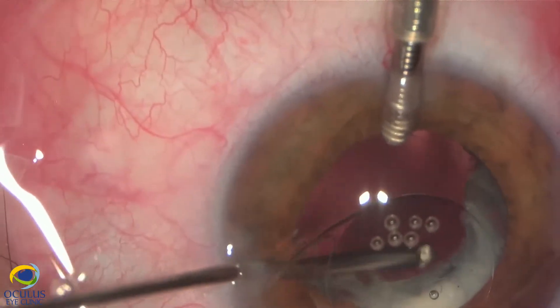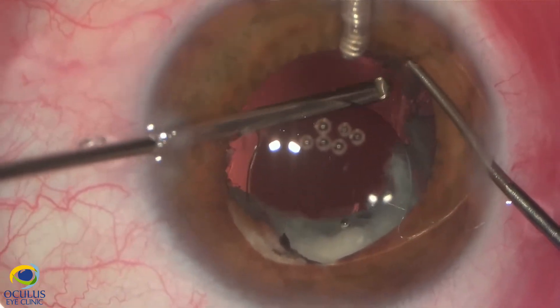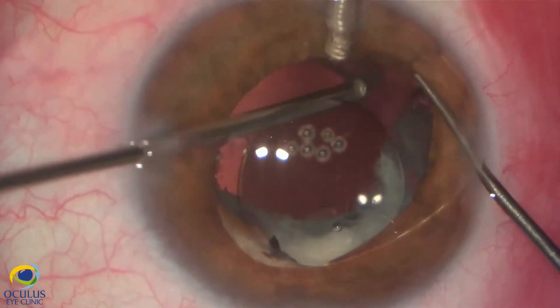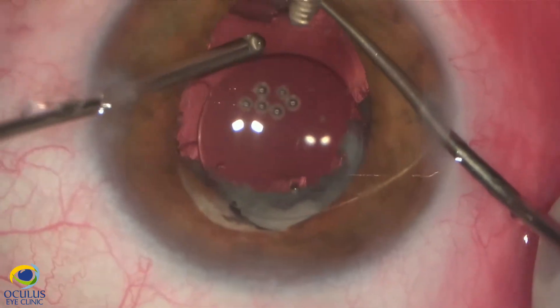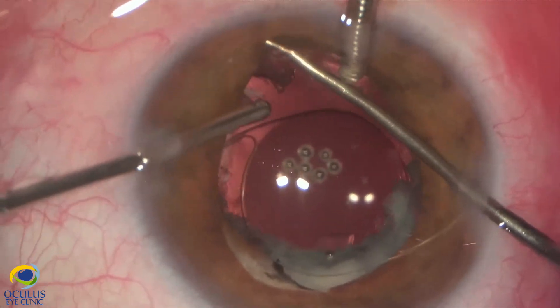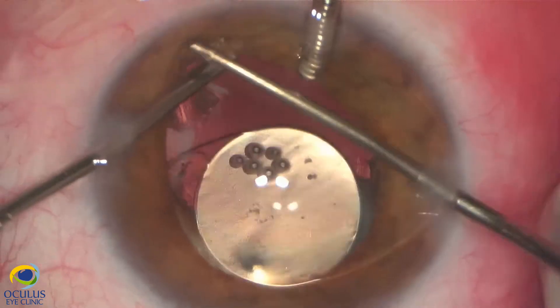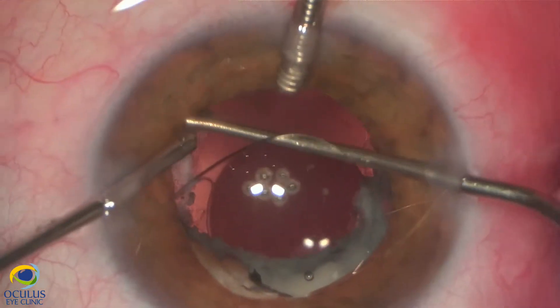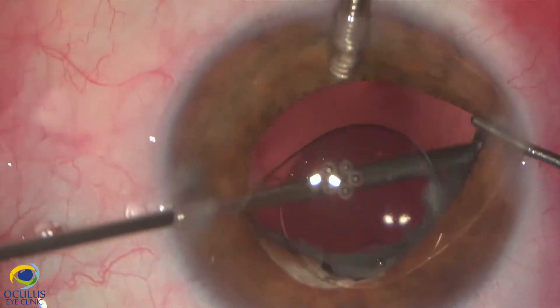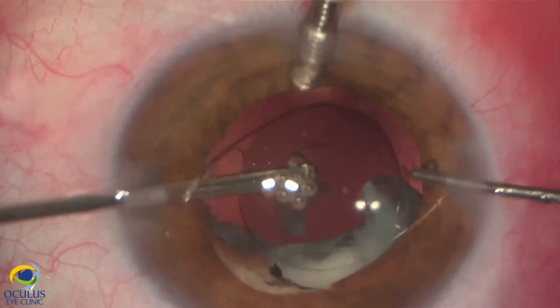At this point you have to play with the foot pedal and switch between vitrectomy mode and IA cutter mode. In vitrectomy mode you should go lower with the vitrectomy rate, down to 500–300 cuts per minute, because the cortex is quite thick. When you go to vitreous cutting and aspiration you can go higher with the vitreous cut rate. Once the vitreous is clean in a certain area, you should move to the IA cutter, in which foot pedal step 2 is aspiration and the cutter is only at step 3.